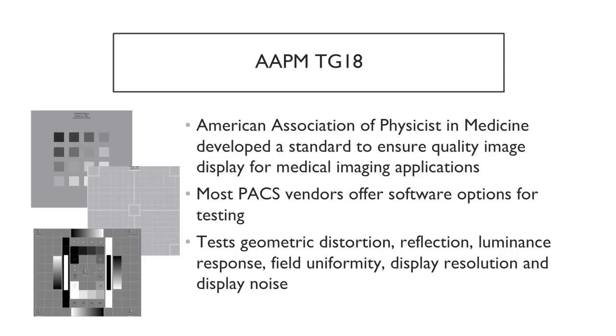Another common tool that you should be aware of is the AAPM TG18, which was developed by the American Association of Physicists in Medicine. They put together a task force that developed a standard to ensure quality image display for medical imaging applications through various test patterns. Most PACS vendors offer software options to incorporate this standard of testing into their product.